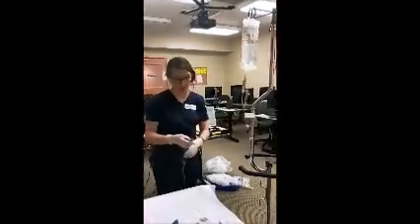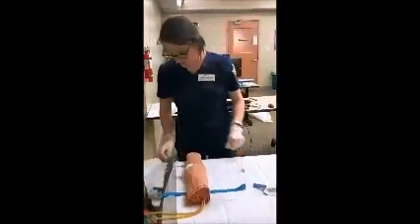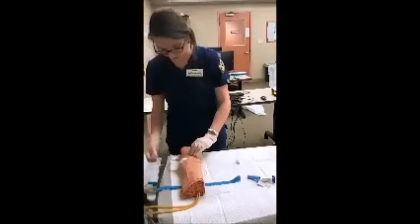Okay, so we're at 21 drops per minute. So now that this is set, I'm going to go ahead, Joe, and I'm going to tape this to your arm so that it doesn't get caught on anything.